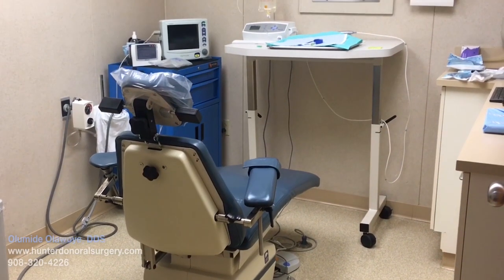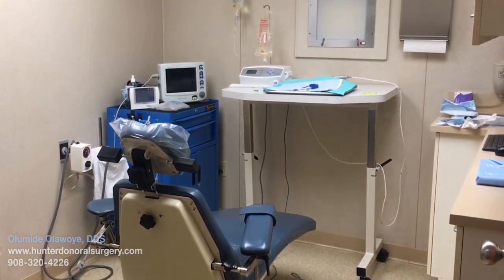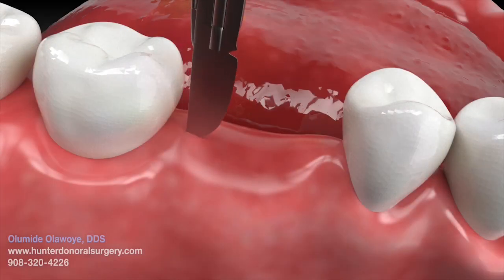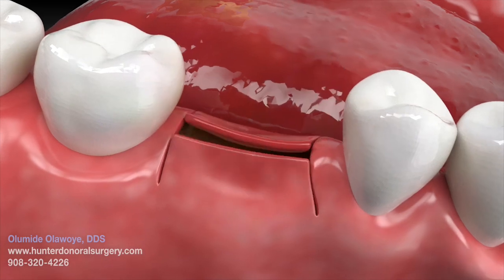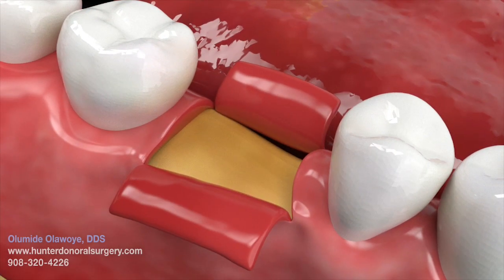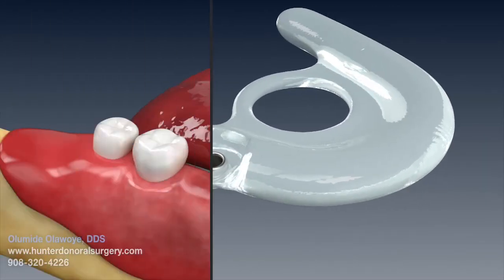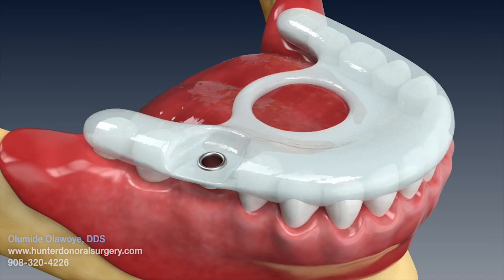Surgery can be done in the office under local or intravenous sedation. A small incision is made in the gum tissue in the area of the missing tooth, exposing the bone surface. Sometimes an incision is not made, but a previously made surgical template guides the exact location of the implant, so an incision is not needed.